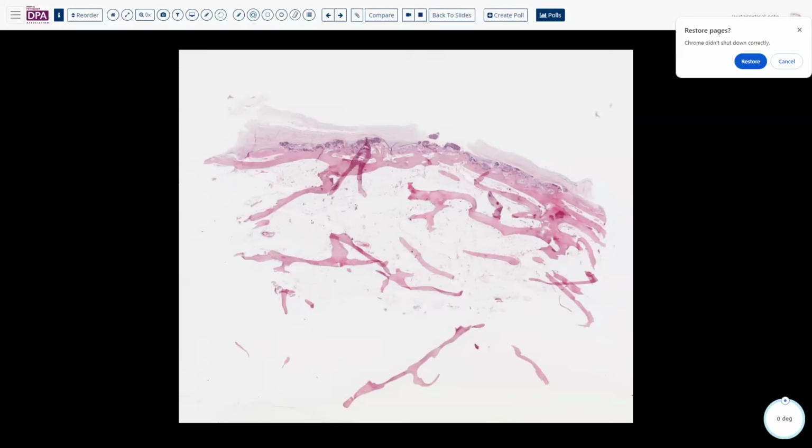Okay, well, we'll go on to another bone case. I was going through most of the bone files in my teaching files, and that's why we've got a few extra bony cases. So this is, I think, a 25 or 26-year-old patient who had a little bit of pain and then was found to have some abnormal distortion, almost as it were, of his tibia. And that led then to some concern that there might be a neoplasm.